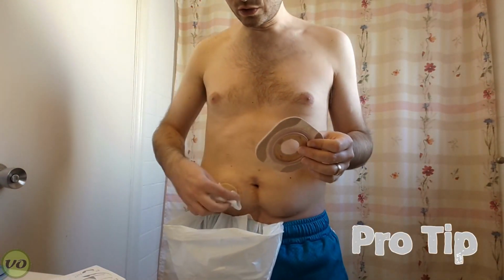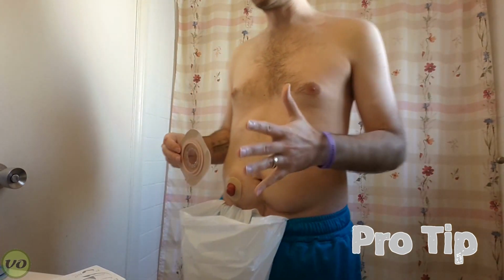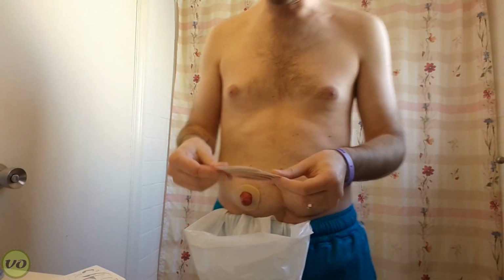So once that's cut out, I generally do a dry run, so without peeling back the liner, I will just make sure that everything fits okay. Yep, so everything looks good. So what I'm going to do here is just take off the release liner.